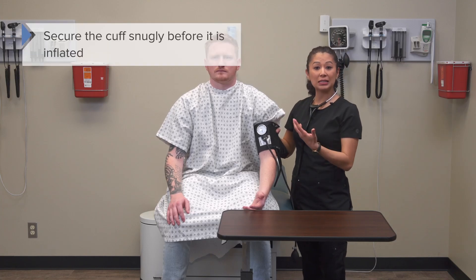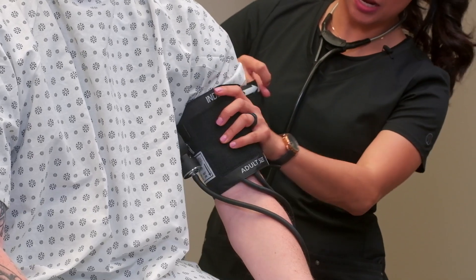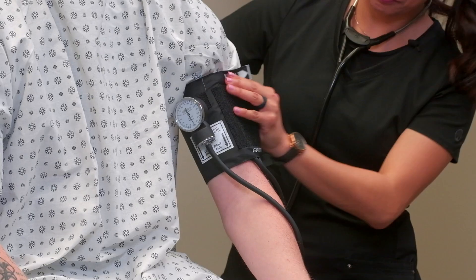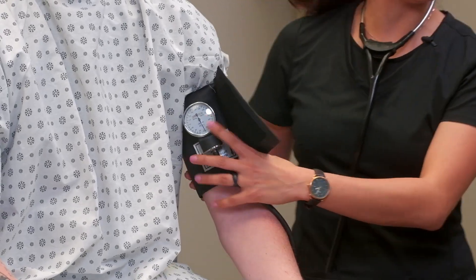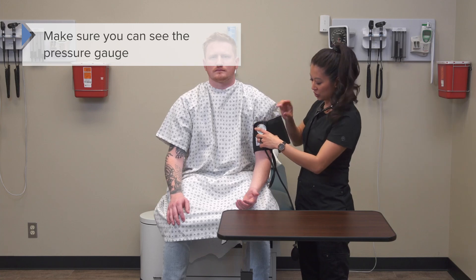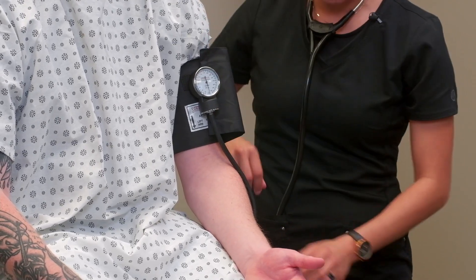When you put the cuff on, you want it snug so it doesn't keep sliding down. Most manufacturers include helpful lines to ensure the right size for your patient. There's an index line on the cuff, and as long as it falls within the indicated range, you know it's the correct size. Going ahead and placing the cuff back on Brandon's arm — it's snug, not sliding, and the pressure gauge is positioned so we can see it clearly to obtain our reading.